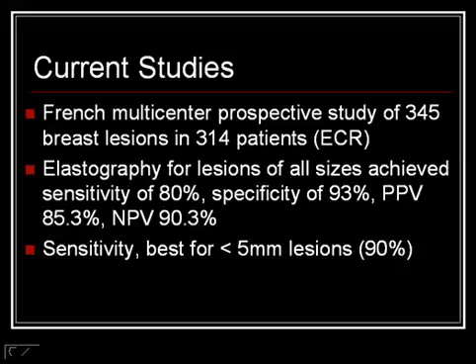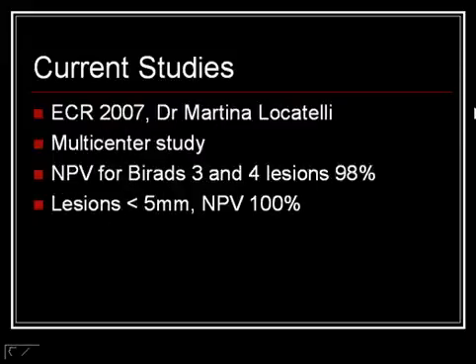What's interesting about this study is that the sensitivity was best for lesions that were less than 5 millimeters, which is very helpful because those lesions are not well evaluated with B mode. So this is a great tool to help further characterize these lesions.